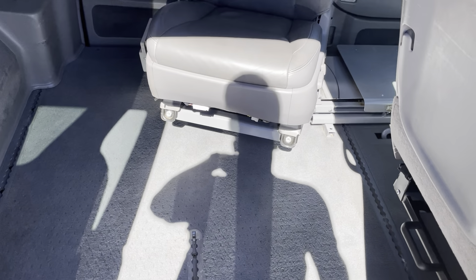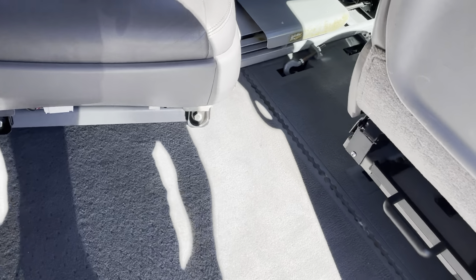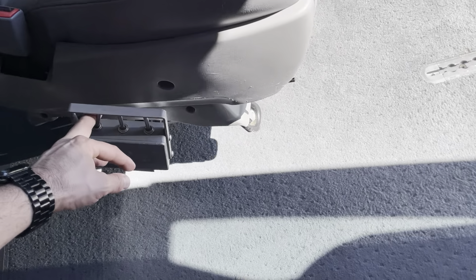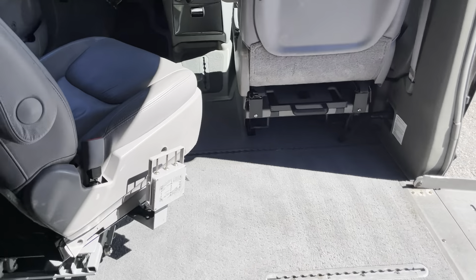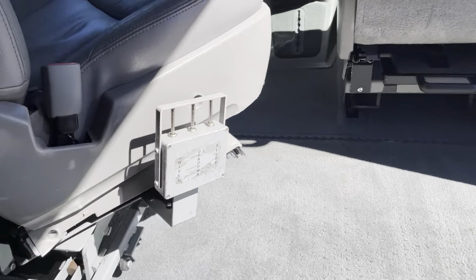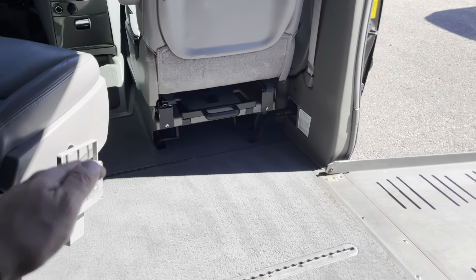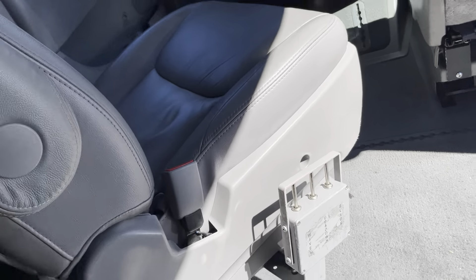You have a space here for the wheelchair with tie-downs there. This has a power transfer seat base, which is currently in the rear position. As long as the vehicle is off, you can actually control the position of the transfer seat to make a transfer into it, and also raise and lower the seat to the height that you want. When you're coming out of the seat, you can come down, and when you're in your wheelchair, you can come over and down into it, depending on the height.